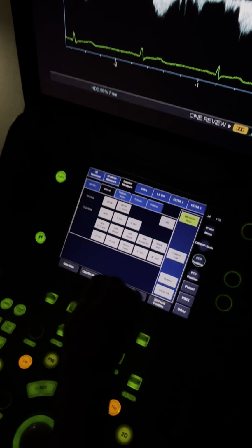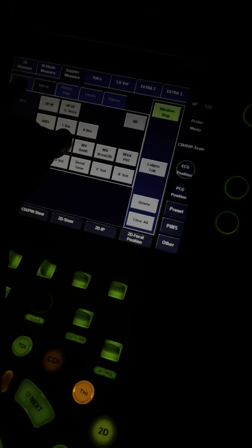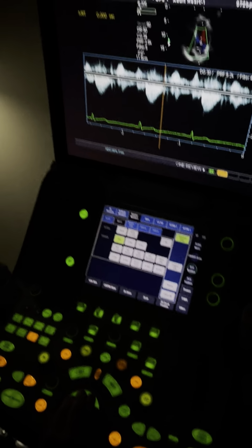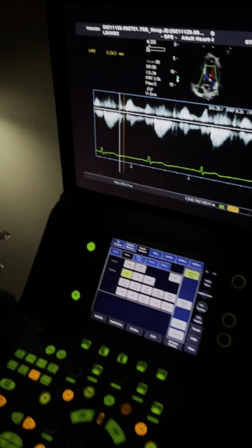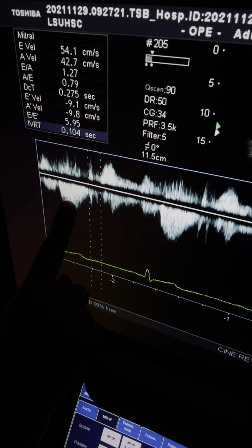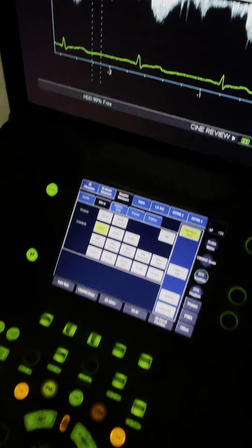It's on the mitral page. It's not on the mitral page. Aortic, right? Aortic page. No, it should be on mitral. Oh, there it is. I see. The first one. No, the big letters. And it's a time from, I'm going to measure this one, it's clear. Is it from the end of flow, when the aortic valve closes, to the beginning of flow when the mitral valve opens? That is what I got wrong.